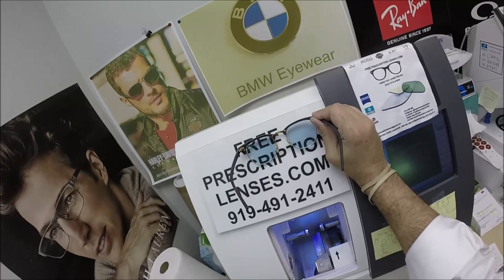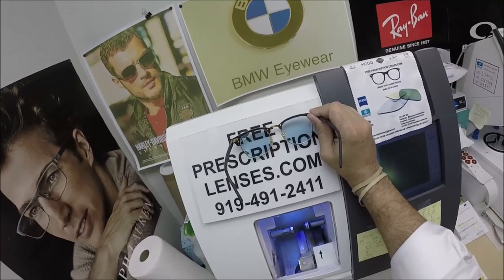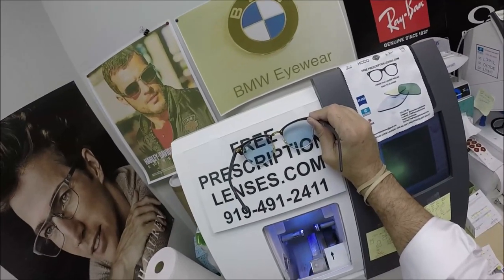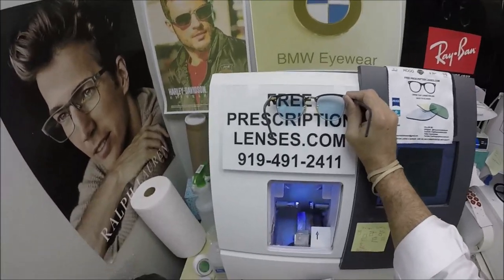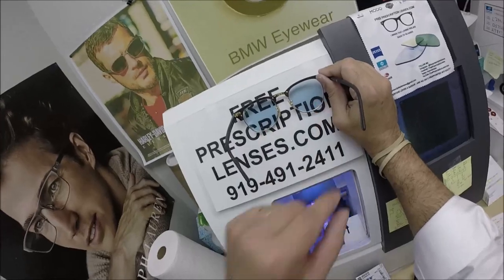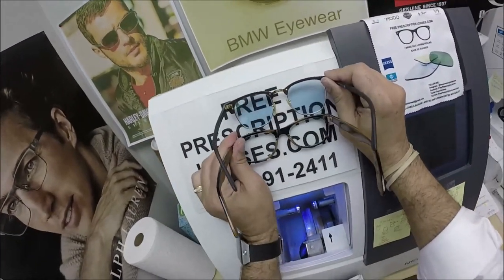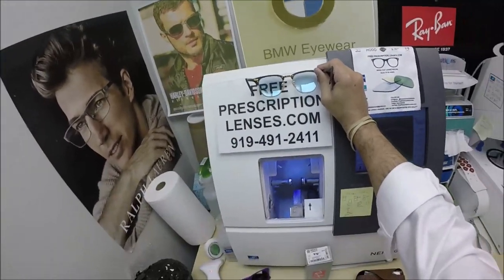Essilor, if you want one of their Transitions Extra Active in gray, they won't put the flash mirror on just their regular colors — you have to get their Extra Active lenses. They will not tint the lens at all. Only Zeiss will do that for you. So fortunately, he wanted the Photofusion blue, and we can do that on top. Normally it's not this blue. I'm wearing the Photofusion blue as well — you can see what mine looks like inside versus his 30% blue on top of the Photofusion.